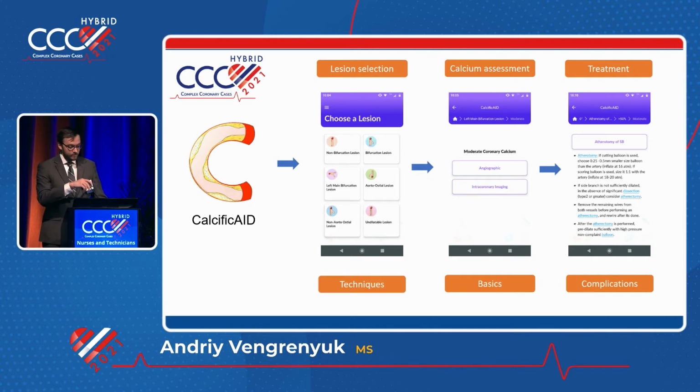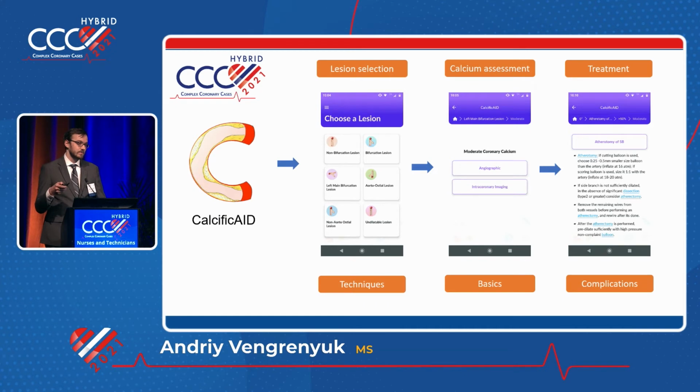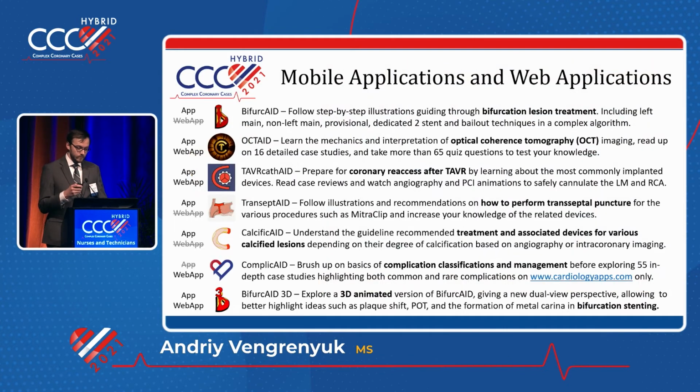So on the very first page, you see bifurcation and non-bifurcation lesions. Undilatable, for example, would be ISR, and then ostial or non-ostial lesions. You proceed to evaluate the calcium on angiographic or intracoronary imaging before being guided through treatment, which is either high-pressure balloon inflation, cutting balloon, or rotational, orbital, laser, etc.